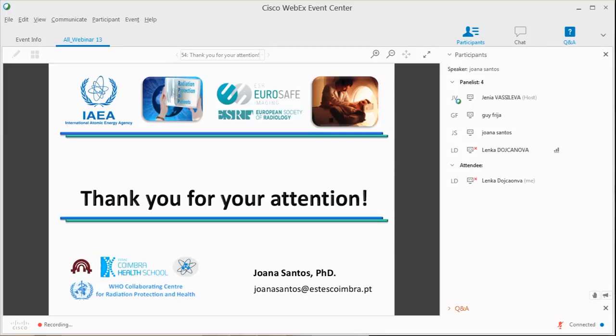In Europe, it's mandatory to have this information in the reports. But it's very important to know the DRLs that we use in our department. I think what is more important to have on the report is to compare the examination that I have performed with the DRL that is established in my department.